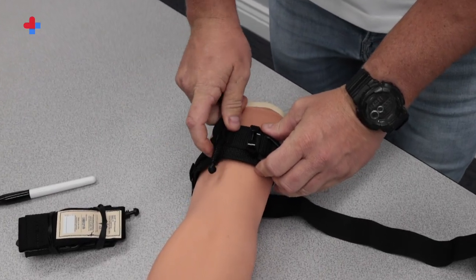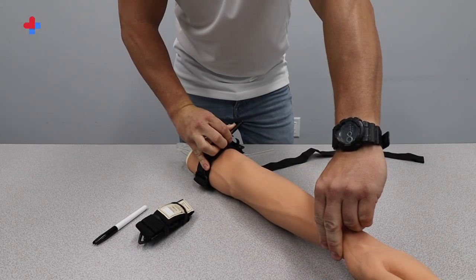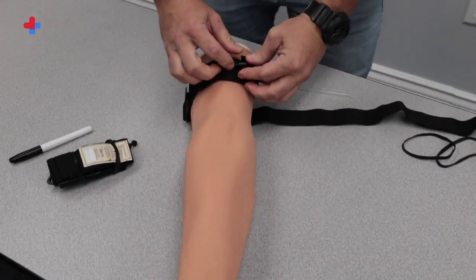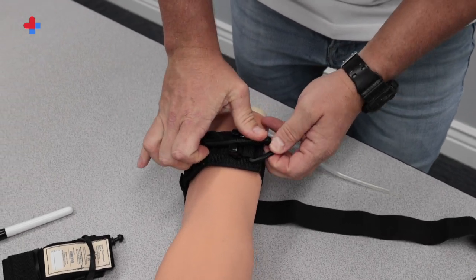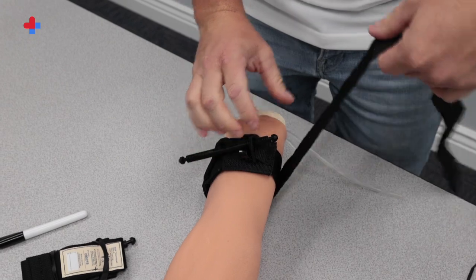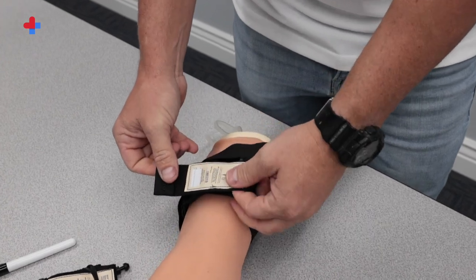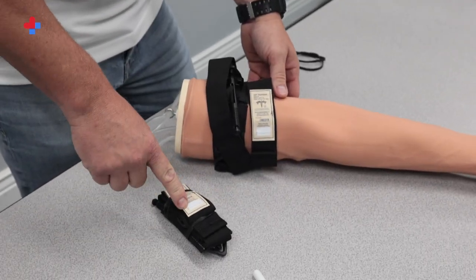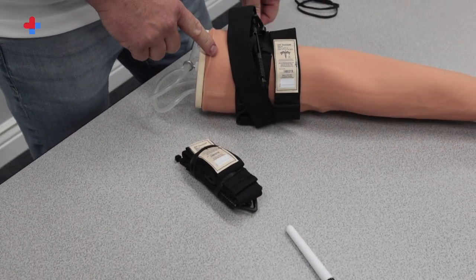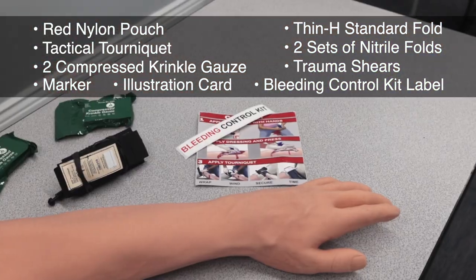Turn the windlass until you no longer have bleeding and a distal pulse in that extremity. Then notch the windlass into the clip on the tourniquet and pass the strap over that and all the way around until you see the white tag. Write the time of application on the tag and make sure the tourniquet is always visible — this is critical for follow-up care. If the bleeding hasn't stopped, a second tourniquet can be applied just above the first one. USA Hockey bleeding control kits are available from One Beat Medical and Training at OneBeatMedical.com.